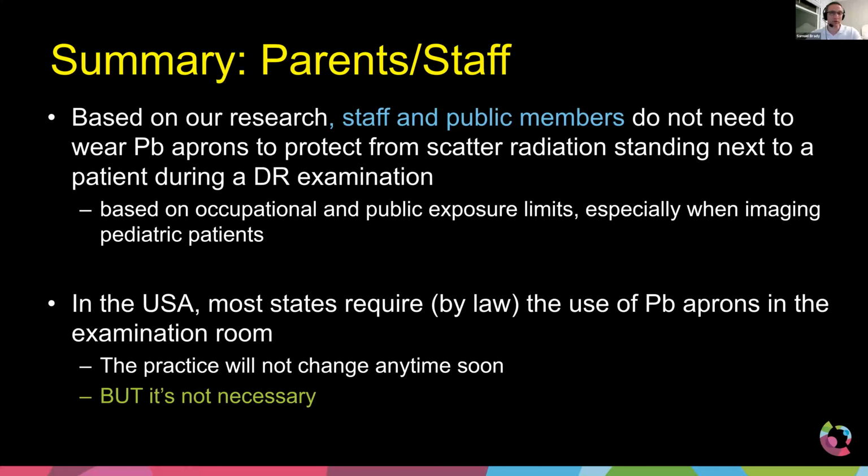It would be simpler that when a parent walks in, they don't have to don all of this lead. It tends to make people scared. And then obviously you have to clean it off. And in an era of COVID where everything has to be highly sanitized, this would just be one less thing that the technologists have to deal with every time a parent or a caregiver walks into the room to help a patient get an x-ray.